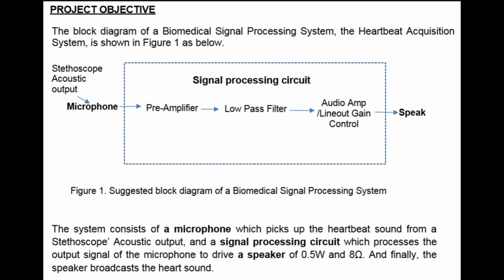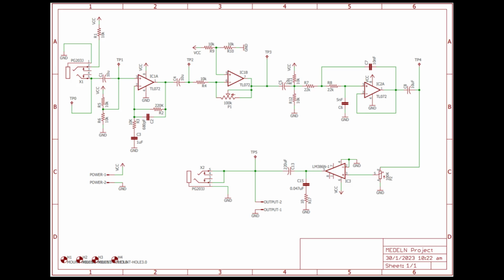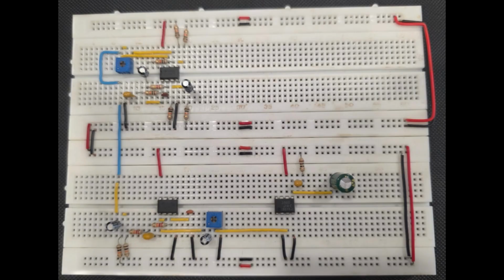Firstly, the preamplifier, followed by inverting amplifier with adjustable gain, then active low pass filter, and lastly, voltage follower plus audio amplifier. So here is the schematic diagram that was given to us. And this is the patch circuit that was done by me.